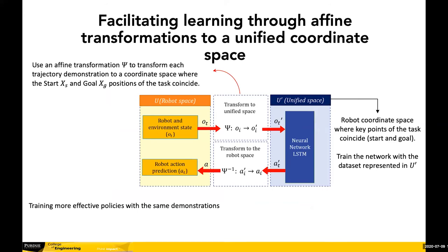We realized that the performance is not so good. So one solution that we found is that we may need to transform every surgeon to be mapped to the same frame of coordinates. The way to do that is to learn the transformation, minimizing the error between these two reference frames. In this case, for the simple scenario, it would be an affine transformation. For every surgeon, we map the transformation to the same frame of coordinates, execute the task, predict the task, execute, and then convert back.